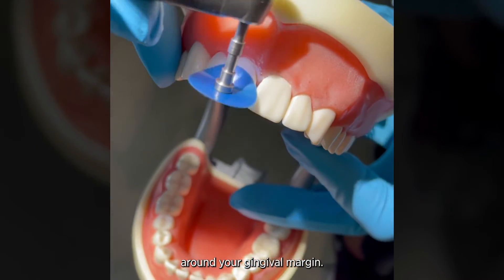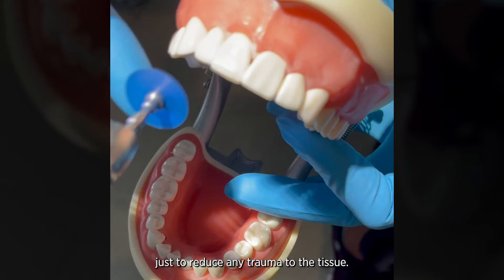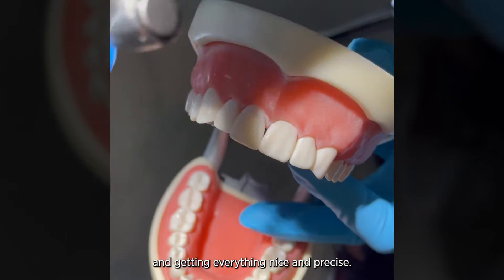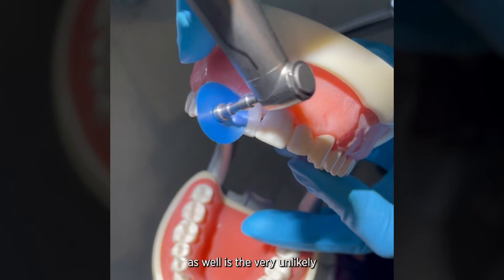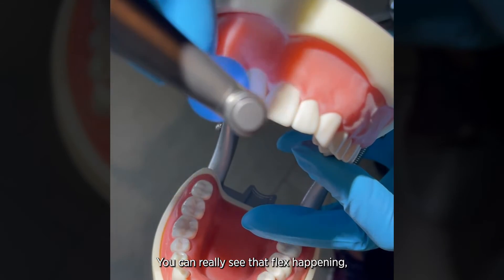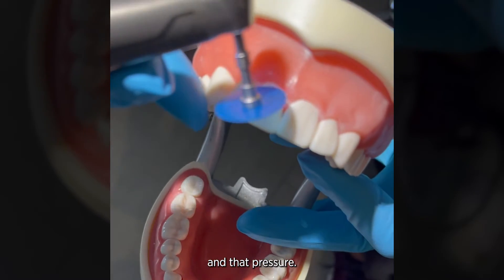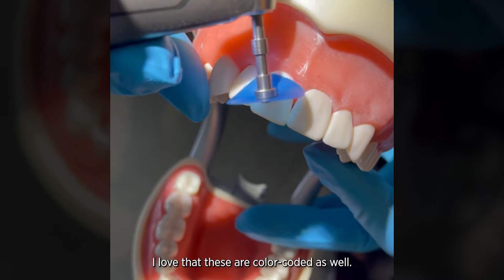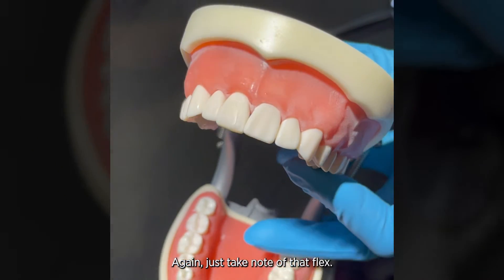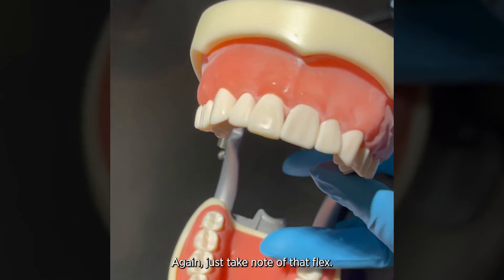You need to be careful around your gingival margin. Typically you'll use a 3/8th disc fill around your gingival margin just to reduce any trauma to the tissue. Really refining my line angles with that blue disc and getting everything nice and precise. The nice thing about these discs is they are very unlikely to cut the adjacent teeth. You can really see that flex and pressure I'm putting on. I love that these discs are color-coded so I'm never guessing the order — it's gray, blue, yellow, and pink.